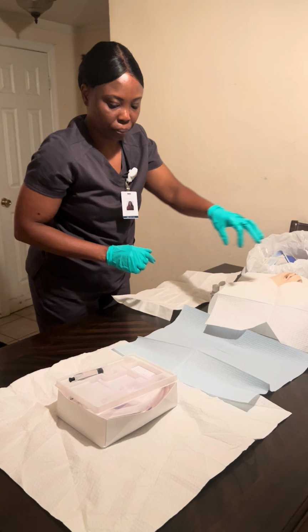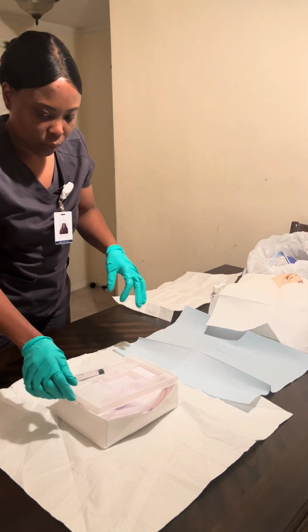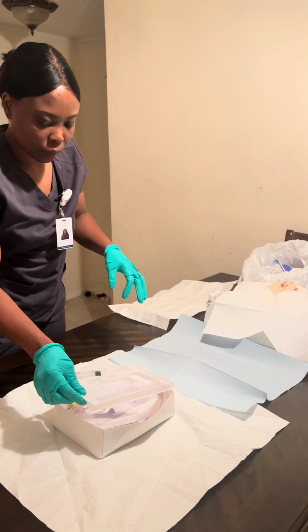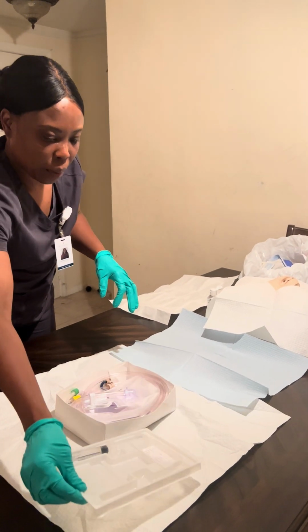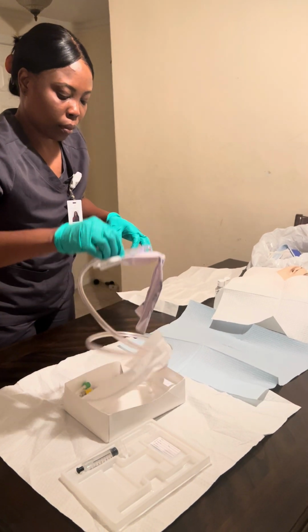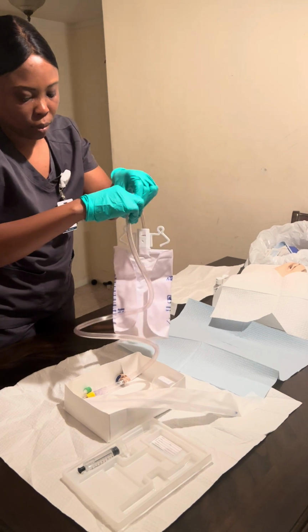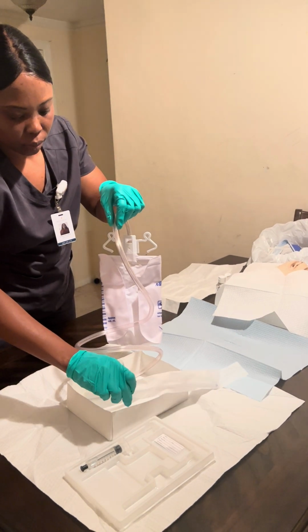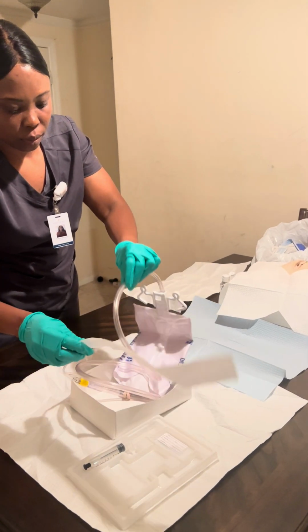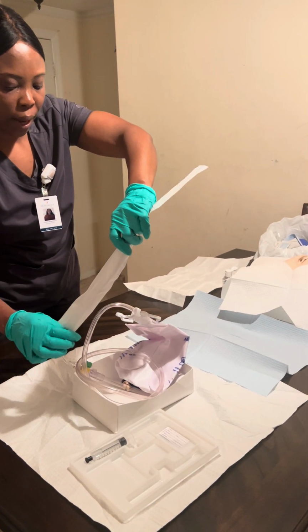Okay, Mrs. Smith. Now, I'm gonna set up my catheter. I'm gonna make sure to take off the plastic bag.